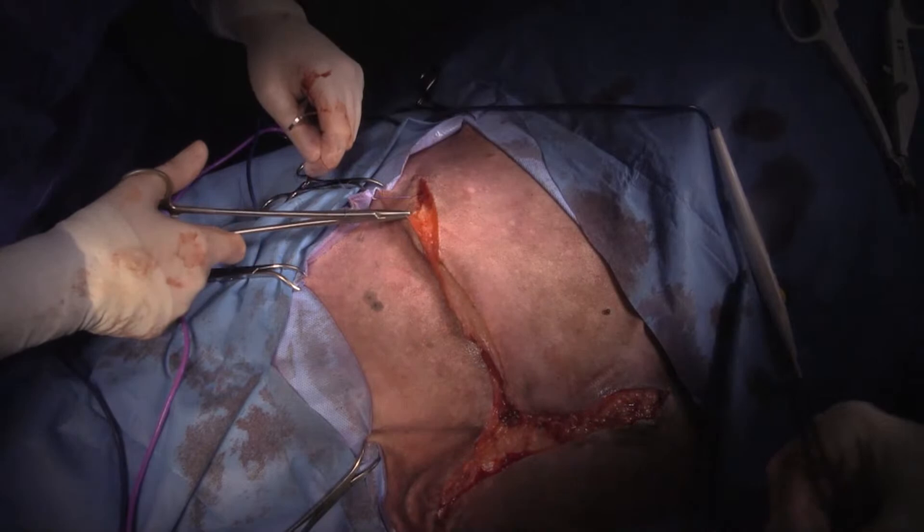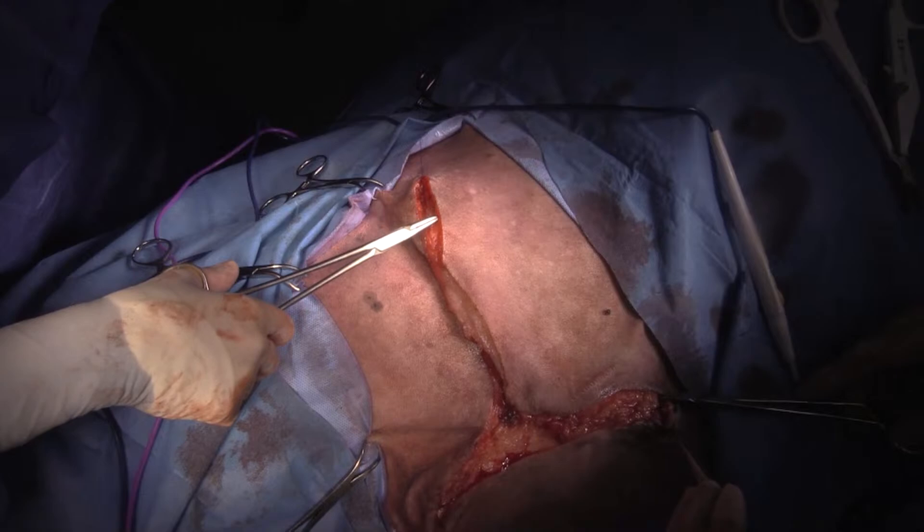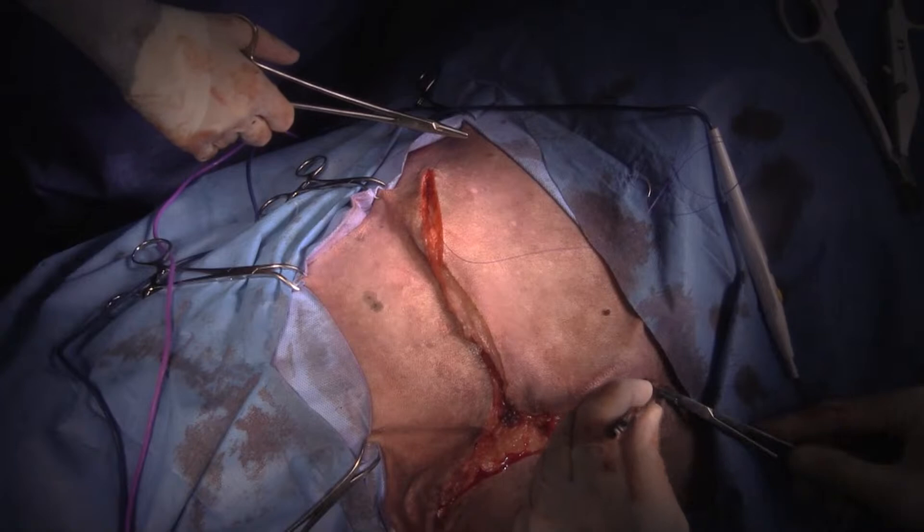I'm just doing an intradermal pattern. You can use mattress sutures if you'd like.